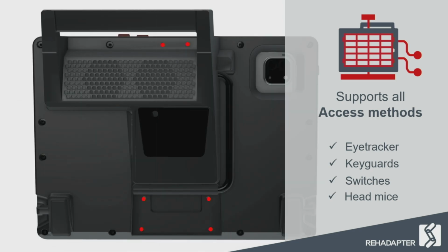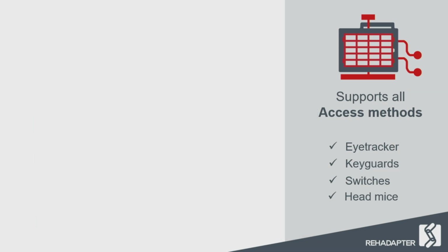On the back side, to make the attachment of these brackets as easy as possible, we have included in all Rehadapters, on top and below, the attachment spots for the individual add-ons that you can put onto the Rehadapter to make the access as easy as possible.